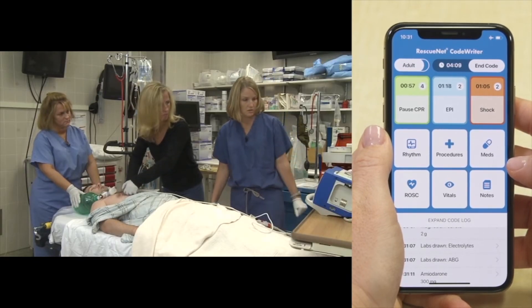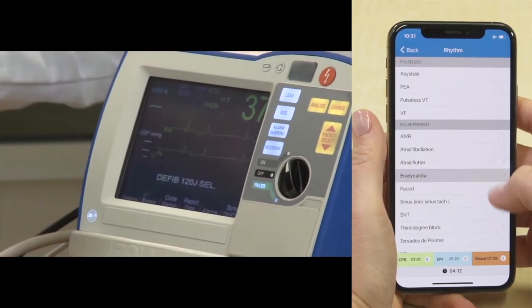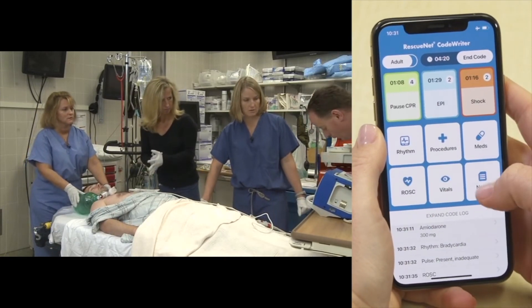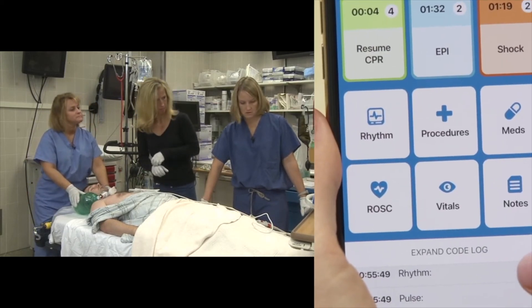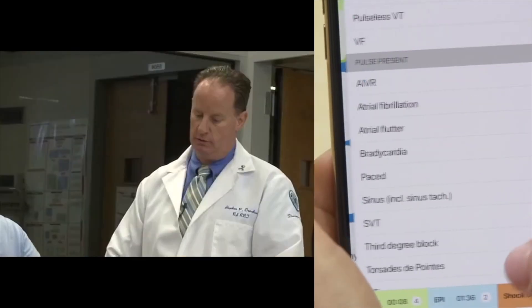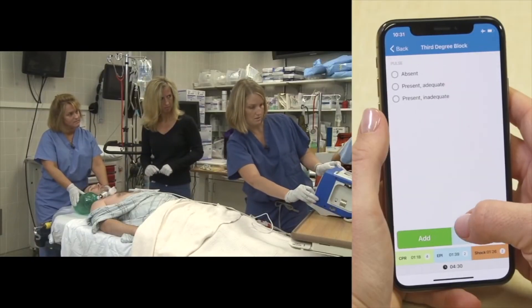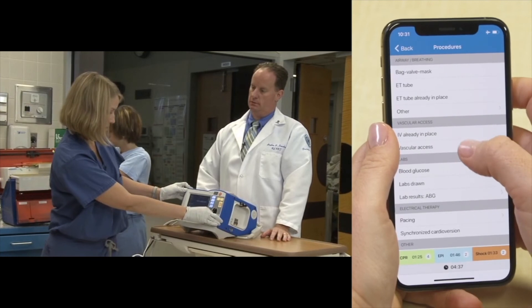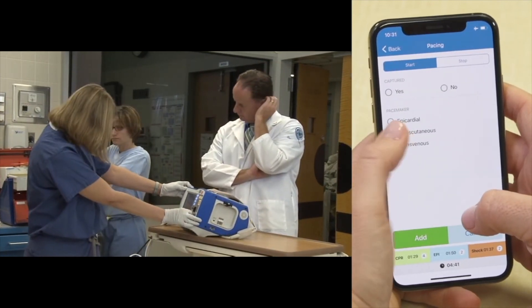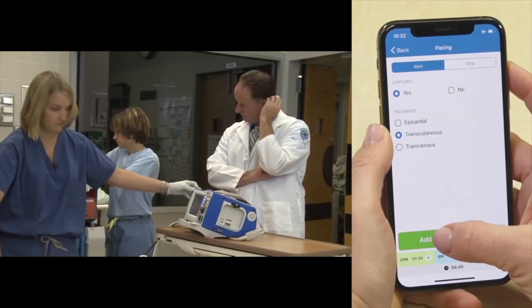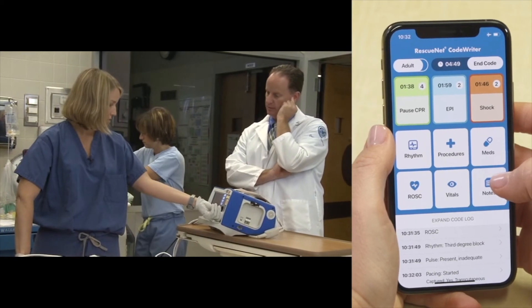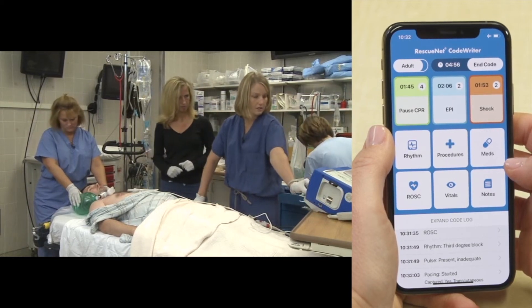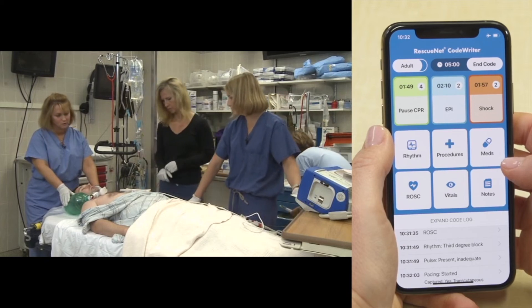With return of a pulse and a third degree block identified, the team orders atropine one milligram but then opts to hold it and proceed directly to external pacing. Capture is achieved at 80 milliamps at a rate of 70, then increased to 80. Dopamine is started at five micrograms per kilogram per minute and titrated for blood pressure. Good radial pulses are confirmed with pacing.